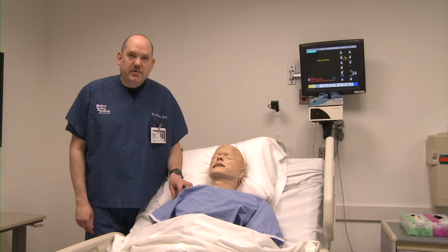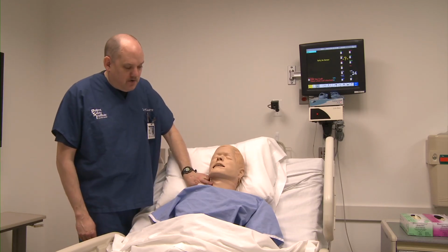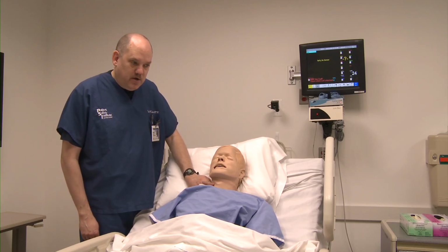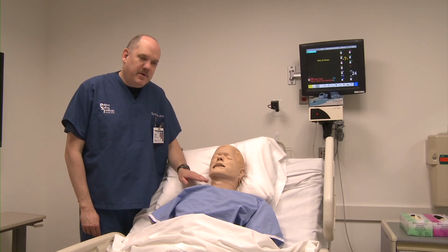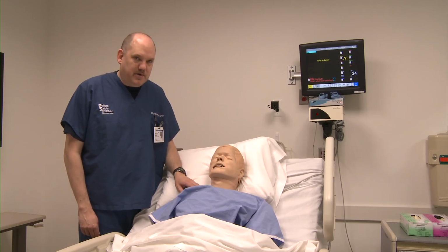There are several locations where you can assess SimMan's pulses. Central pulses may be assessed at the carotid, and the carotid pulses are relatively medial. They're right next to the larynx, and it requires a little bit of pressure on the skin to make the pulse activate and become palpable. You need to know that the carotid pulses, after they are activated, will only run for about 5 to 10 seconds. After that, they will shut off, and you'll need to repalpate to re-engage the pulses.